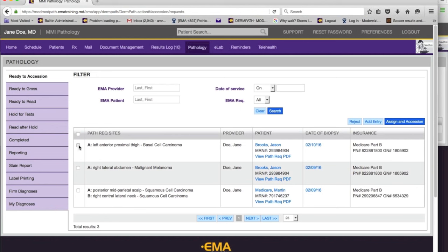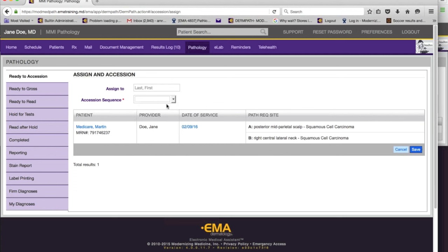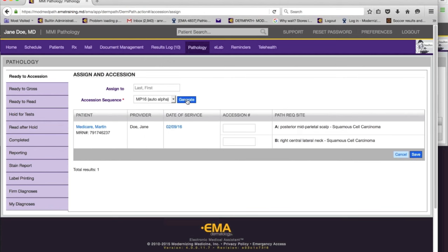Now let's accession the requisition. If you do one at a time, you select it and say 'assign an accession.' Here you can optionally assign it to a dermatopathologist, then pick the sequence — if you have only one sequence it will be preselected. If I go with the auto sequence and say generate, it generates the numbers for me — EMA manages the process. It's 1001-A and B. EMA generates numbers that will never be duplicated, and we also check while saving to the database that there are no duplicates.